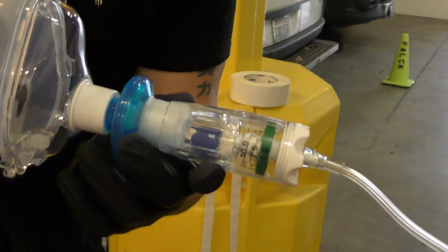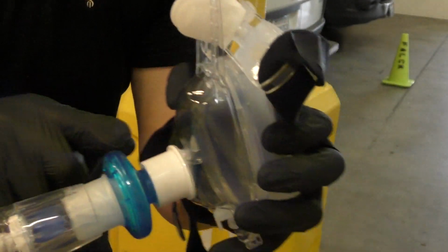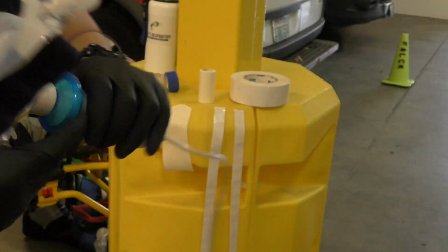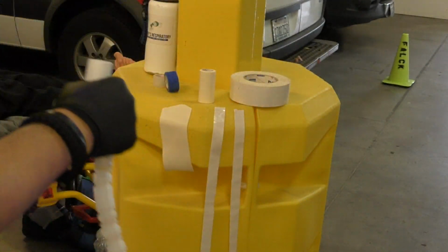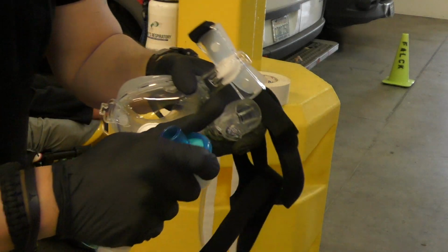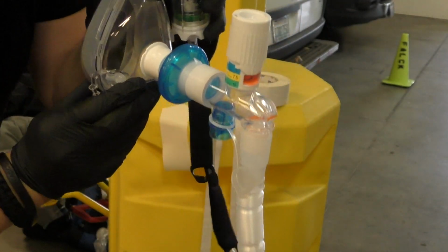Again, with this, it may add some resistance, but we want to protect everyone, because we have our exhalation here, and we have a closed mask, and then we have this filter protecting everyone. Okay, so that's ready. And these GoPAPs are the same inner diameter. So what I did with that filter, I could do with this one too. See how we go here? And that should fit perfectly there too. So you don't have to change it for the different type of mask.